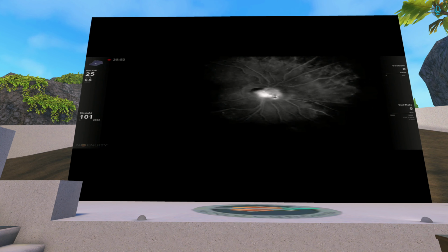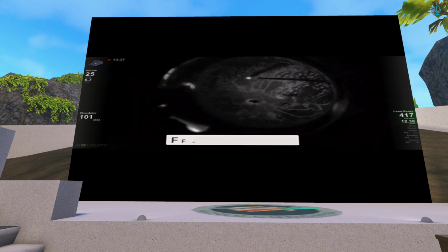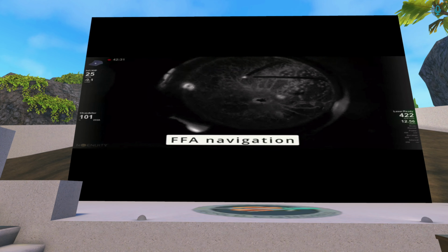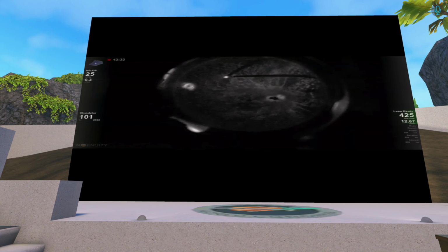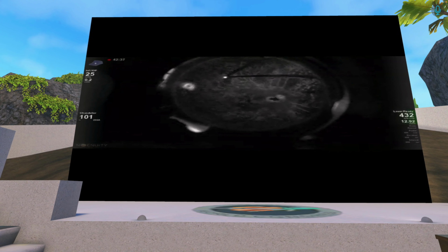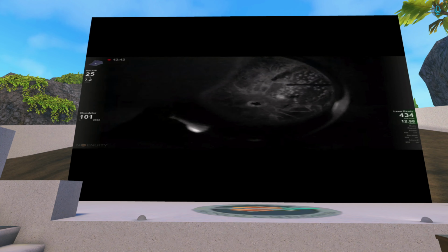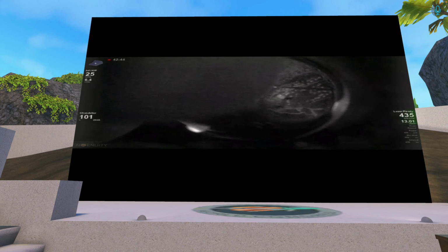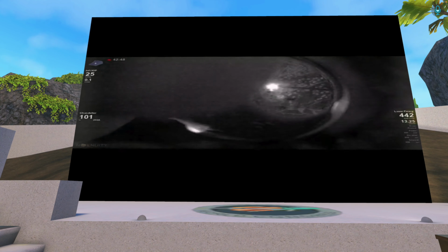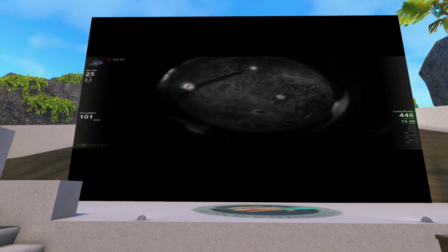Yeah, the other thing we sometimes found is that, depending on how we do our barrier settings, we'll see the choroid versus the retinal vasculature better or worse. Do you find that at all? With this filter that I'm using here, basically I see everything. I see the vessels, I see the choroidal circulation, and I see the capillary dropouts.